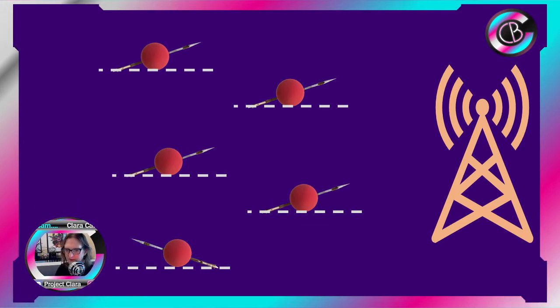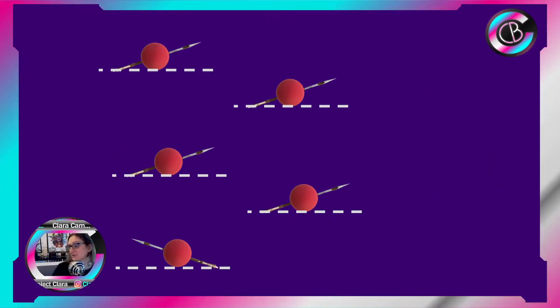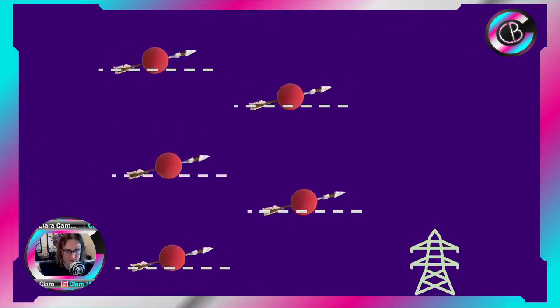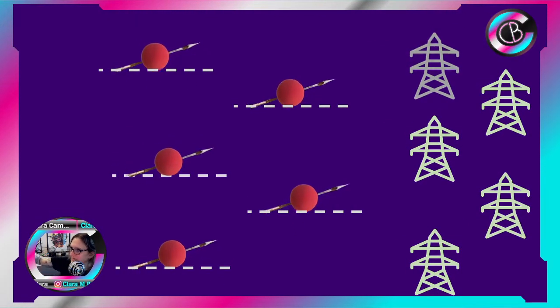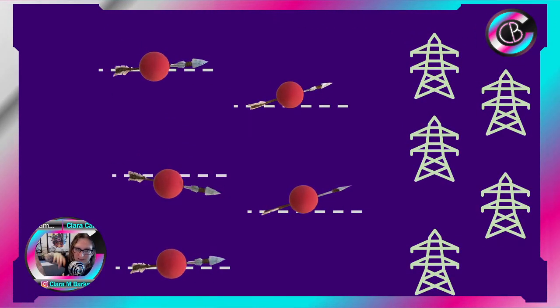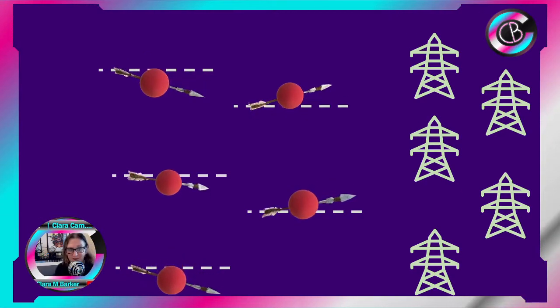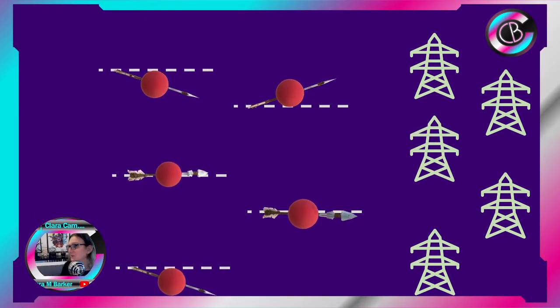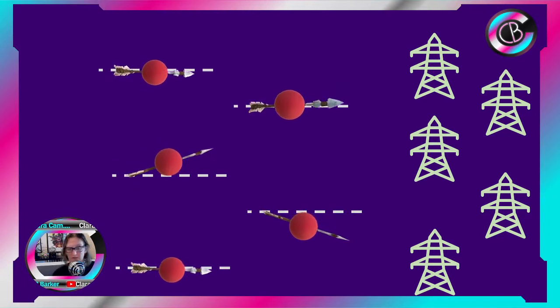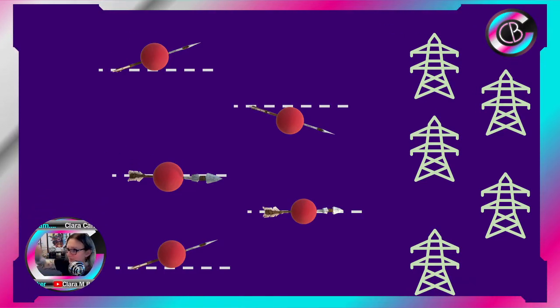So what happens when we remove this energy? Well, they basically want to return to the state that they were in. So the ones that were flipped want to try and move back, and when they do that, they will release some energy. And then, like I say, these are all spinning, but they don't want to be all in phase. They want to be out of phase. They want to be far apart. They want to spin where they're happiest, at their lowest energy state. So slowly over time they'll move out of phase. They'll start spinning in their own particular directions.